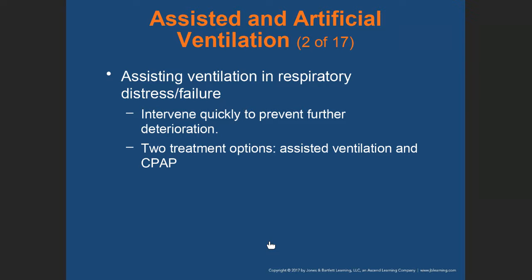Because the patient is close to failing, we must anticipate that. So in the field, if I had this patient on high flow, I would now be getting ready to manage his upper airway with airway adjuncts and breathe for him, because he's going to get to that point if he's in severe respiratory distress. So I need to start getting my airway adjuncts ready, my BVM or pocket mask, my suctioning device ready, and anticipate that. In the field, that's the approach.